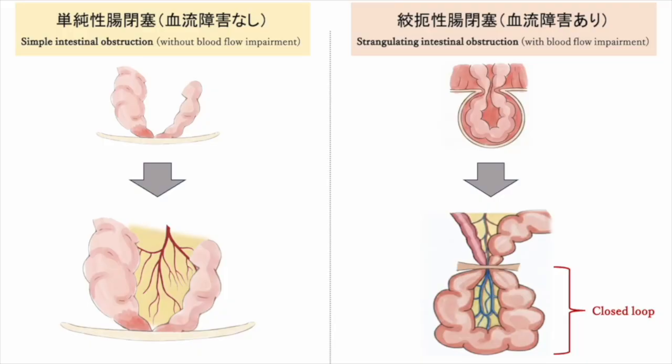position. Otherwise, inadequate blood flow will cause it to become necrotic and rupture, leading to peritonitis or sepsis and potentially death. Thus, when interpreting imaging for ileus, once you identify ileus, you must localize the obstruction and assess the cause in the presence of a closed loop in order to determine whether emergency surgery is required. That's the key to saving lives.